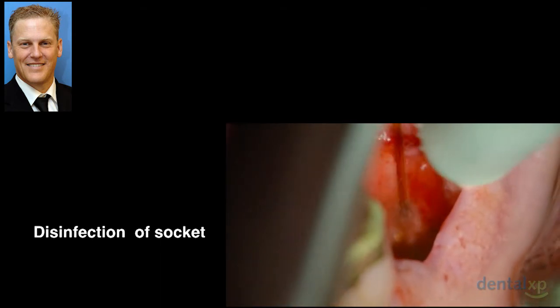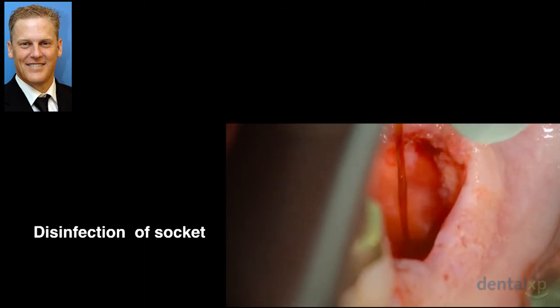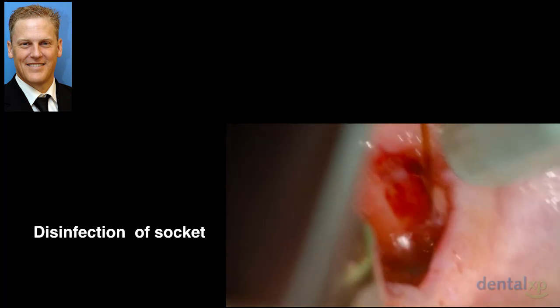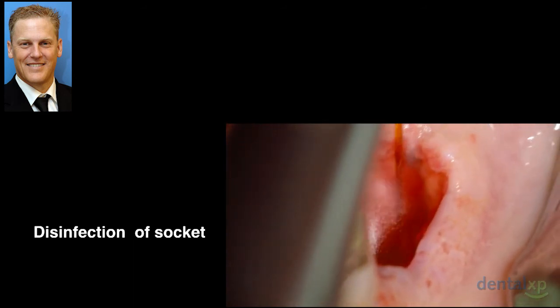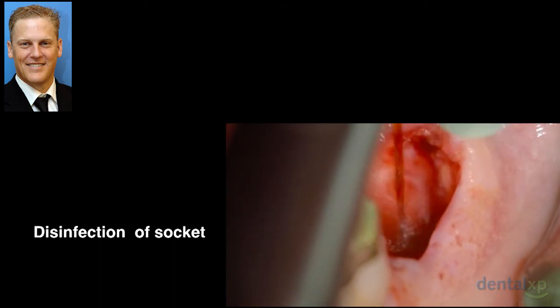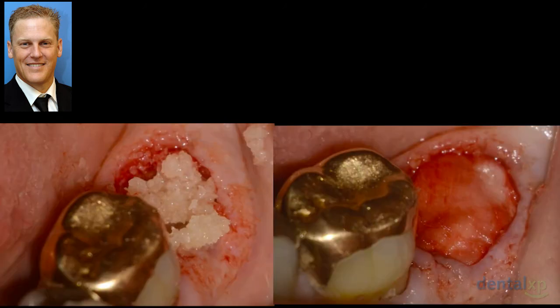At this point, we bring in a radially firing tip where 85% of the energy goes laterally. And you can see tremendous photoacoustic streaming happening here, which is responsible for these microexplosions that will immediately kill bacteria. I want to show you that again in slow motion to show you the tremendous photoacoustic streaming that's happening here with the microexplosions occurring in the extraction socket. When you combine this with degranulation on the external epithelium, you can create a nice site for your graft. Regardless of what you use, in this case an allograft and a resorbable membrane, you are able to close this site and return another day.